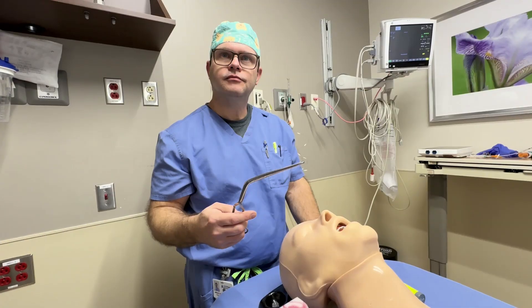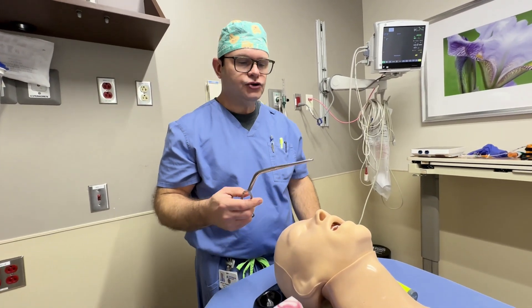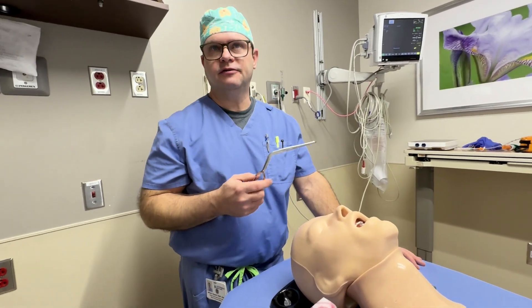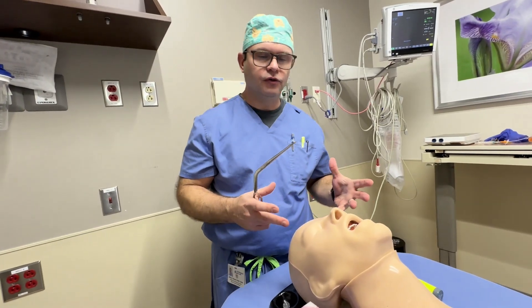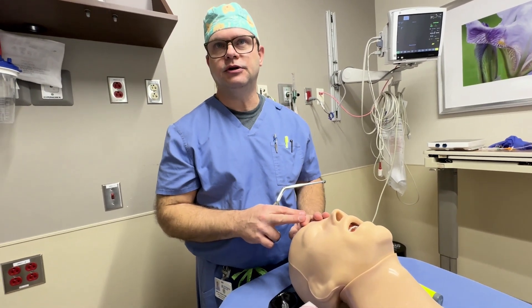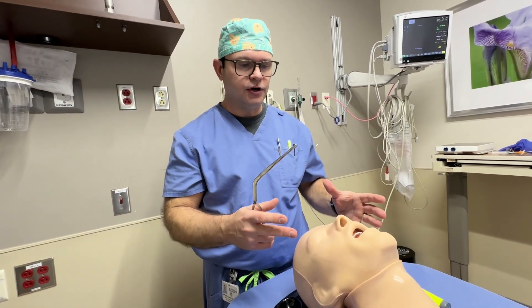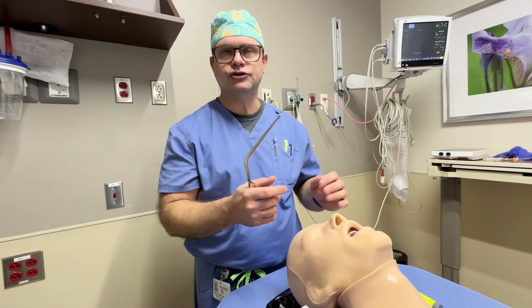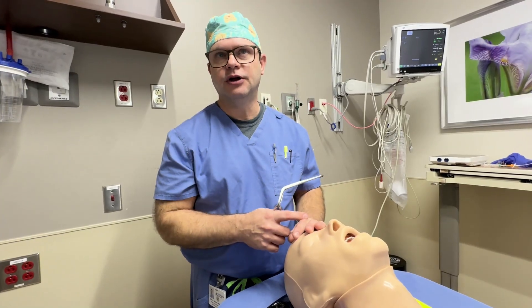How often do you find that you're doing nasotracheal intubations? Nasotracheal intubations vary with the type of procedures performed at a facility. Any time we're seeing oropharyngeal surgery, a nasal intubation is going to be the preferred route because it gives the operating surgeon an unimpeded field of view. Total dental extractions are a great example. Tongue-based work is another great example.